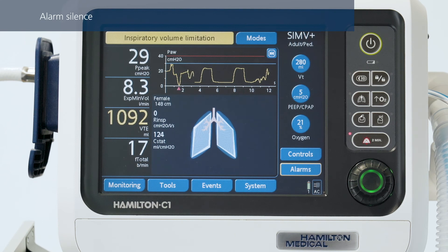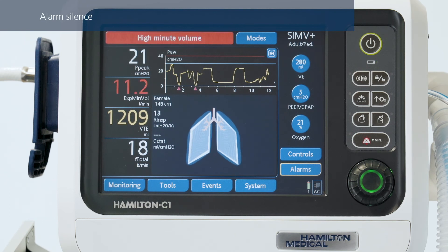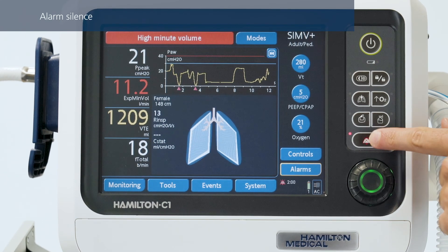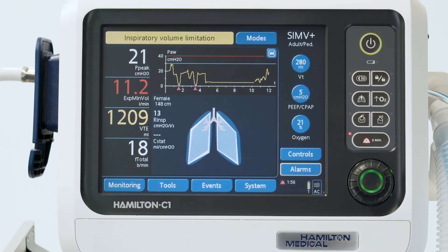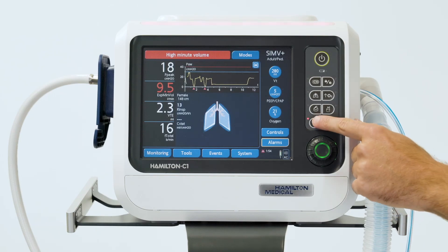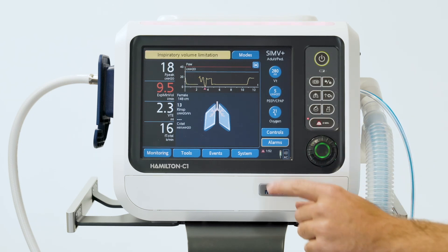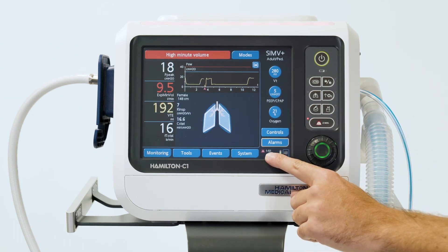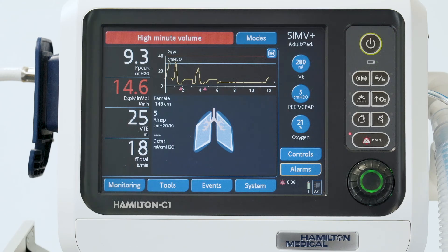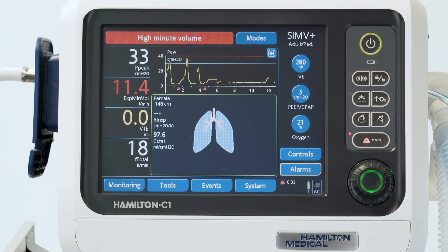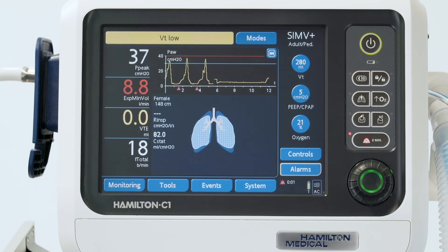To silence an alarm, just press the alarm silence key. Alarm silence is activated for two minutes. When alarm silence is active, the red indicator next to the key is lit continuously, and a countdown timer shows you the remaining silence time. If the alarm condition persists after the two minutes have passed, the audible alarm resumes.